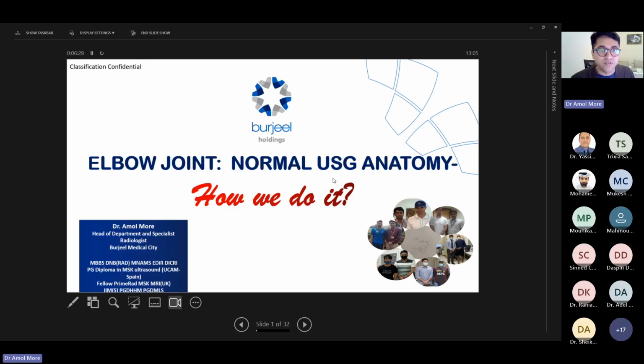I will be discussing the elbow joint and what normal anatomic evaluation will be done for ultrasound of the elbow joint. This talk is properly curated based on the competency requirement suggested by the scope of practice of DOH. So it has to be given importance by all the radiologists who are practicing in Abu Dhabi and Al Ain, Emirates. Particularly when it comes to MSK ultrasound, there are three components which we should be giving importance.